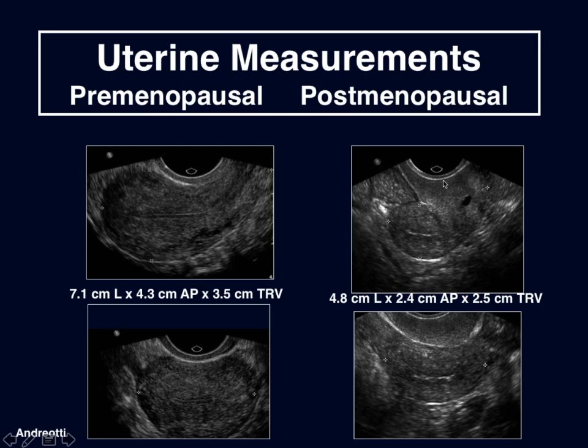Also, another thing to note is that once again, when a patient becomes postmenopausal, the cervix becomes larger again with respect to the corpus of the uterus. Cervix, corpus.